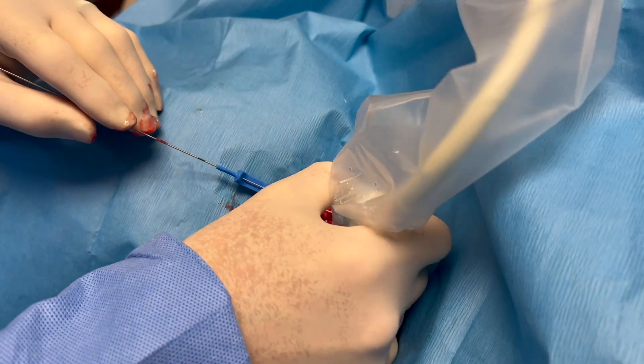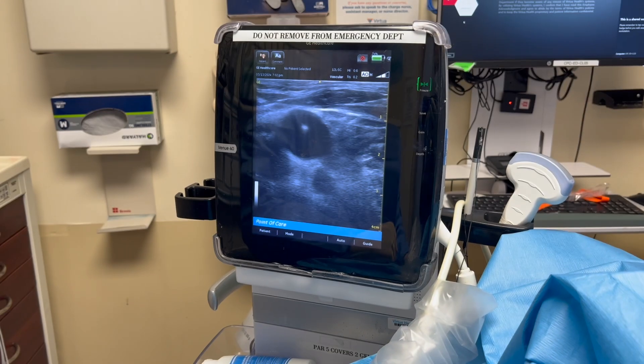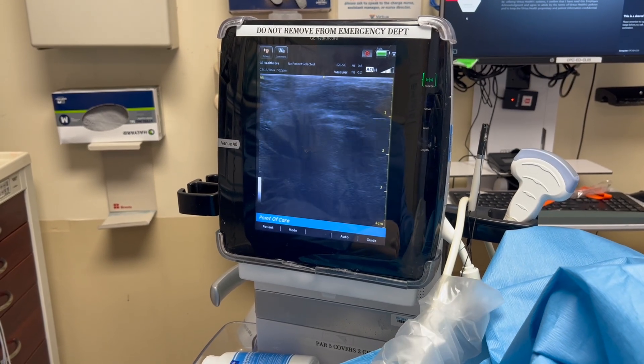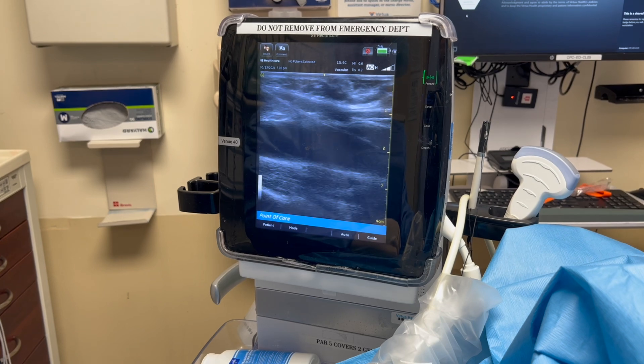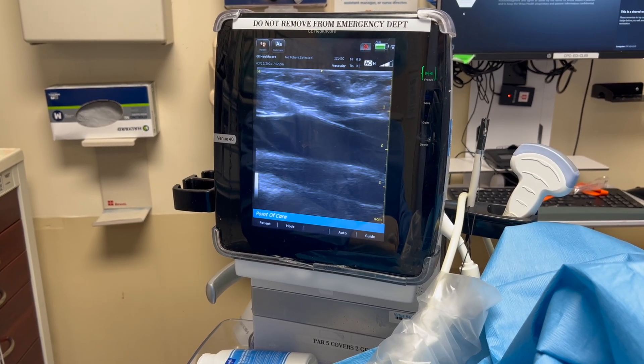Once the wire is in, I always like to check its position with the ultrasound. You can see it transversely — there's the wire sitting in the internal jugular vein on this patient. And then if we look at it longitudinally, you can see the same thing: it goes into the vein and stays in the vein. It doesn't go through into the artery.